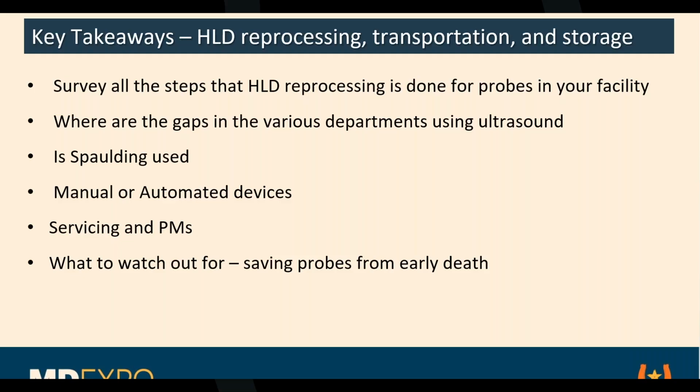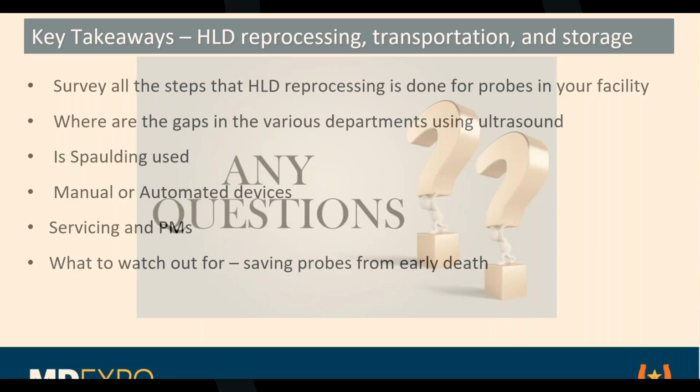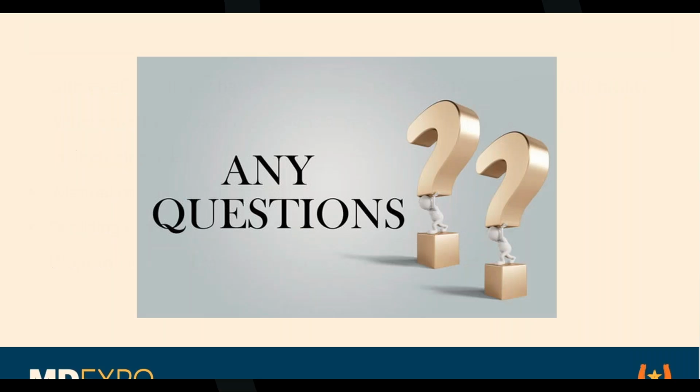Visualize those used in a clinical procedure that exposes them to biopsy needles or close quarters with any kind of metallic or hard ceramic where they can get broken, and deceleration trauma as well. Okay, any questions? Covered a lot.